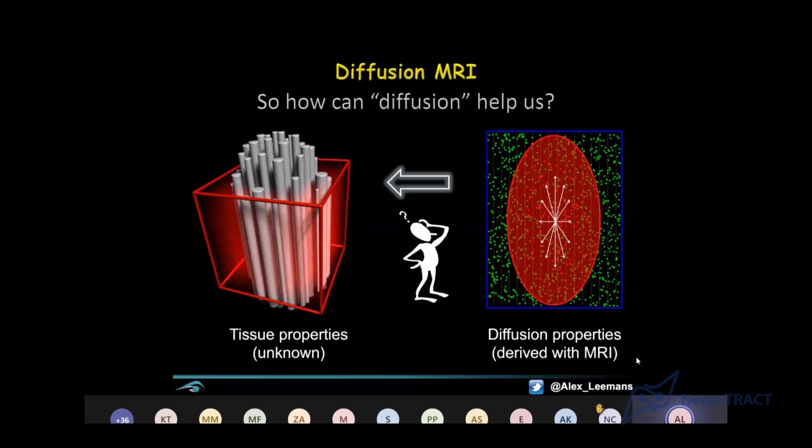And so if at the microstructural level, at the micrometer level, tissue is breaking down, the water molecules are at the nano level, and there are many of them, feeling their environment. You have to think of it like that. Then that process of feeling diffusion, if you can capture and quantify it, says something about how the tissue is breaking down as well.